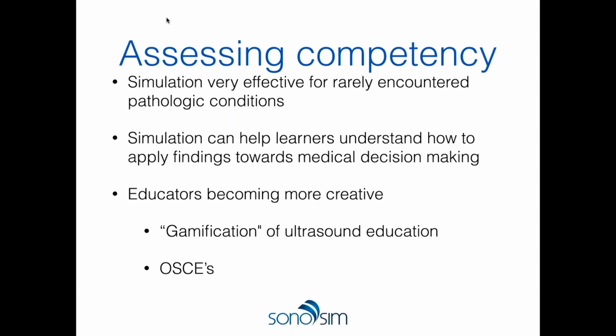When we think about assessment of competency, we also think about observational assessment. And again, simulation can be very effective for rarely encountered pathologic conditions. That patient with a rupturing AAA, or the woman who's presenting with vaginal bleeding and a rupturing ectopic pregnancy, those cases are difficult to come by, especially when you want to present them to multiple learners. And so simulation can help learners understand how to apply the ultrasound findings towards medical decision making.